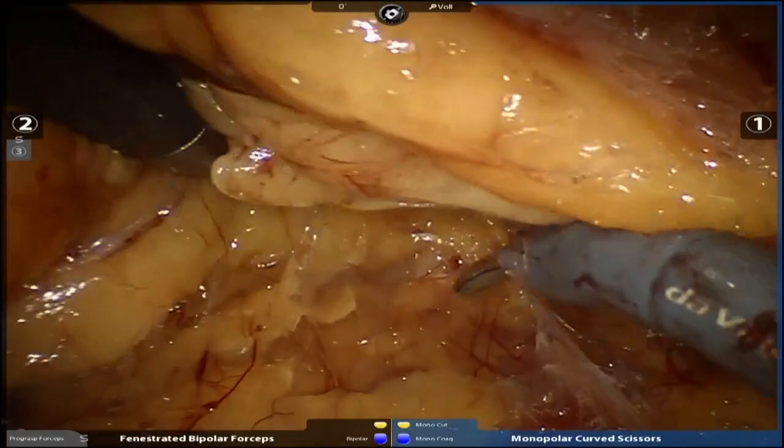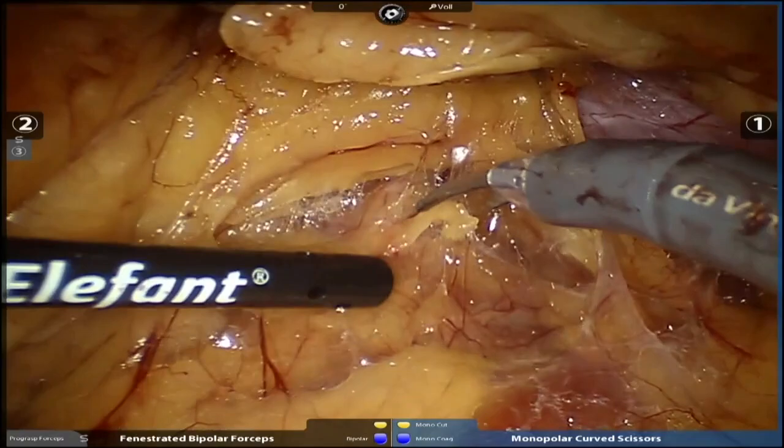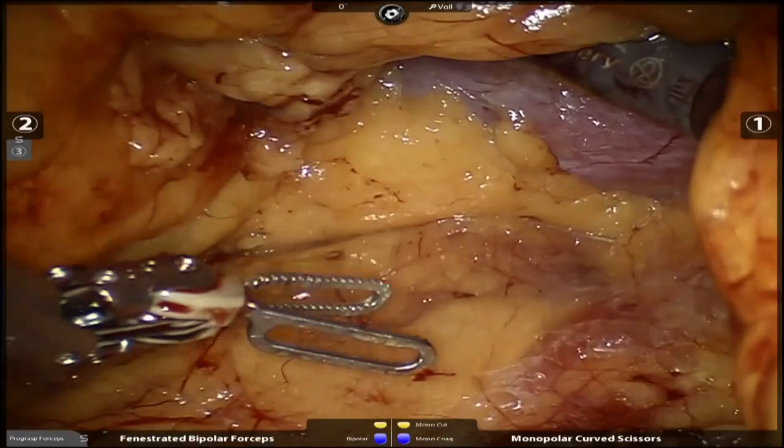So we see the artery already. There's the artery right there. So you can see within minutes, literally minutes, we have the artery in view. And the nice thing about the retroperitoneal approach is it's the first vessel you see, not the second vessel. Unlike transperitoneally, you'd have to work around the vein to get to the artery. With this approach, we see the artery first. So now I'm going to get my fourth arm in to help me.